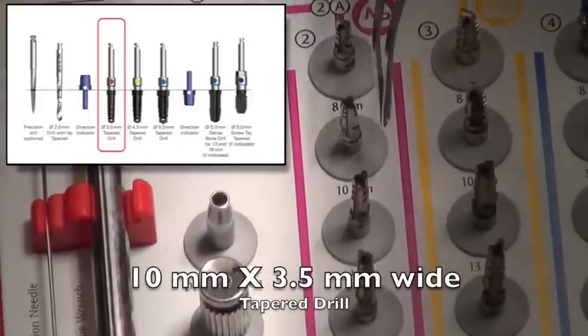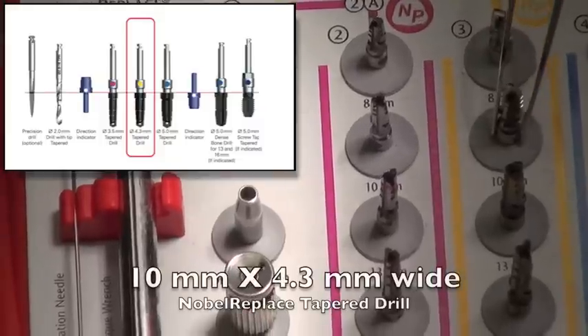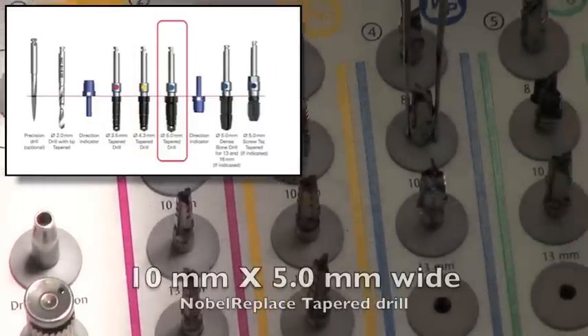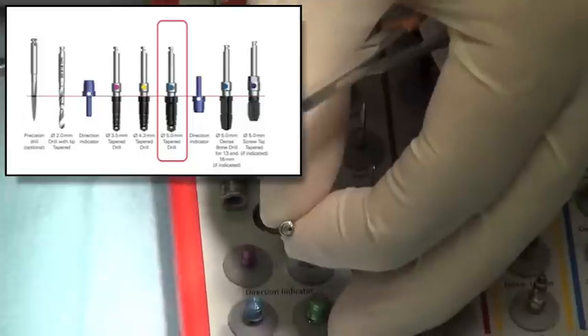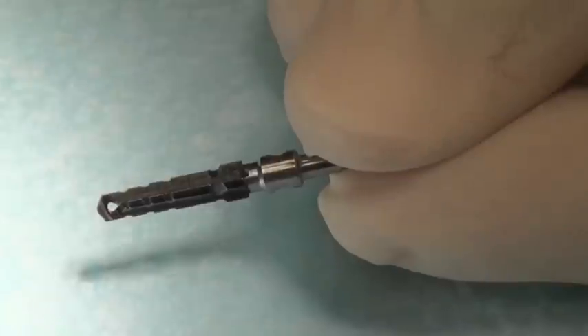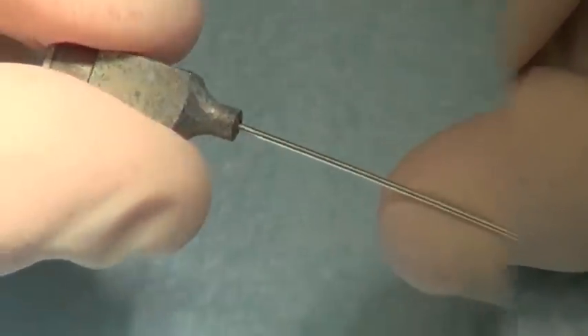We're going to then start with the tapered drill. So we start with a 3.5mm, in this case a 10mm long, and we go sideways to the 4.3mm by 10mm long, then the 5mm by 10mm long implant drill. You can see inside the drill it has a hole in the end of it, which allows for a dual type of water cooling system.